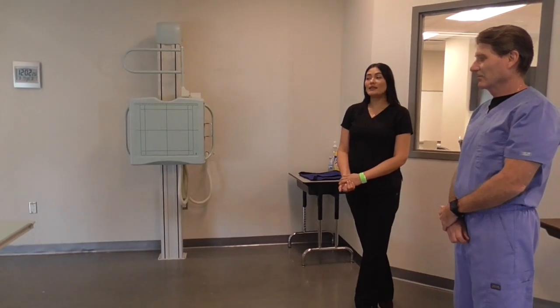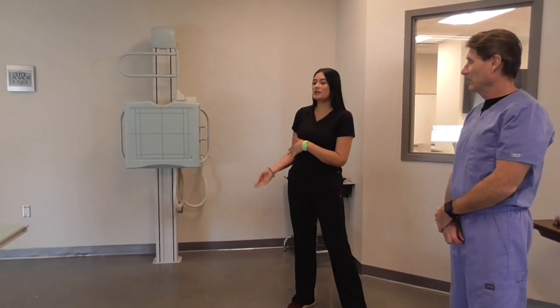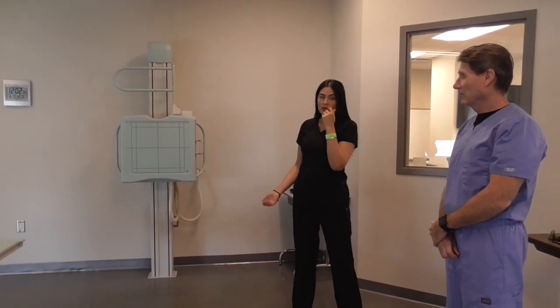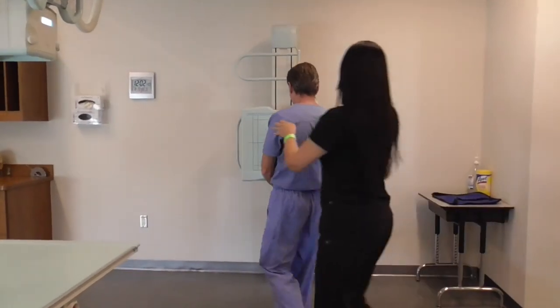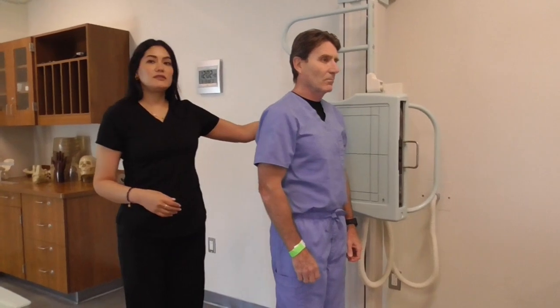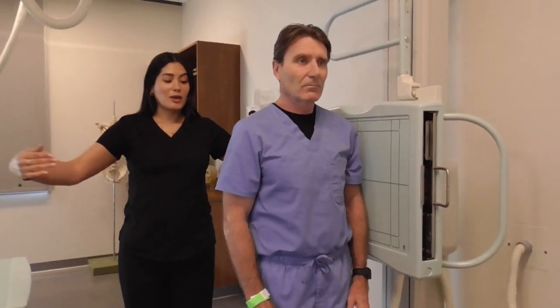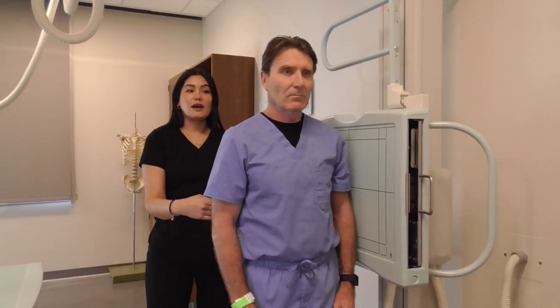We will now be demonstrating the lateral positions. Remember, all these positions can be done either laying down on the table or standing up at the wall bucky. We're going to do our left lateral first, so the left side will be closest to the IR. The X-ray beam will come in from his right side and exit the left side. This is our left lateral position.